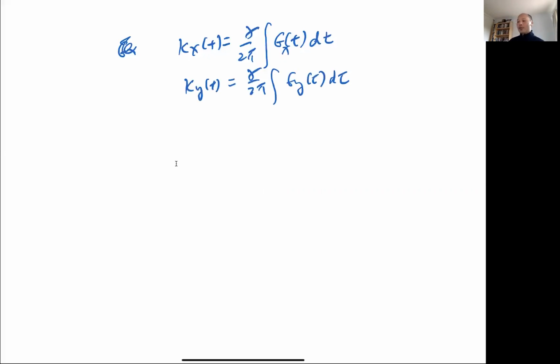So we know that where we are in k-space is simply related to the area under the gradient. So you're given this problem where we want to move out to this point in k-space of 0.1 and 0.2 inverse centimeters.